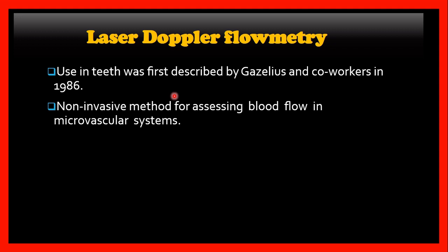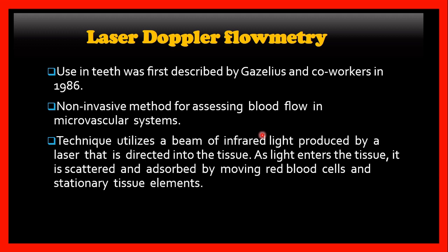As we have discussed, it is a non-invasive method for assessing blood flow in the microvascular system, and this technique utilizes a beam of infrared light produced by a laser, which is directed into the tissue, and as the light enters the tissue, it is scattered and absorbed by the moving red blood cells and the stationary tissue elements. So what happens in that case?